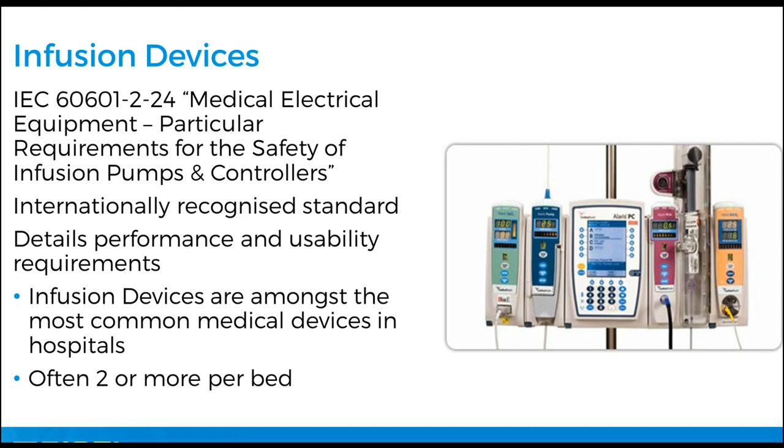Because infusion devices are really common, often more than two to a bed, it would be good to become informed with the standard, familiarize yourself with some of the mathematics that's used and how stability is put together within the standard, especially over periods of time to get average flow rates. So that's something useful. The MultiFlow in particular is a device that is fully compatible with the 60601-2-24 standard.